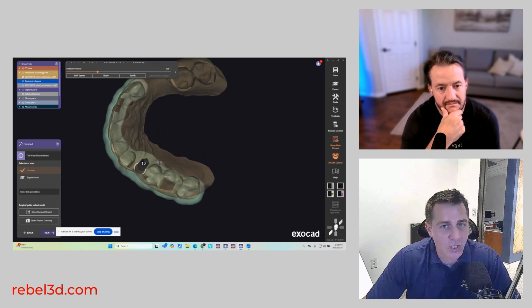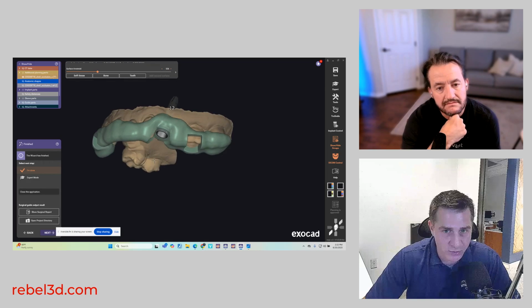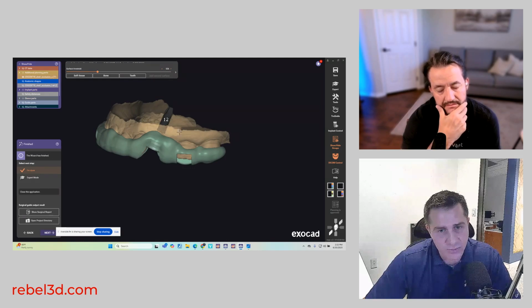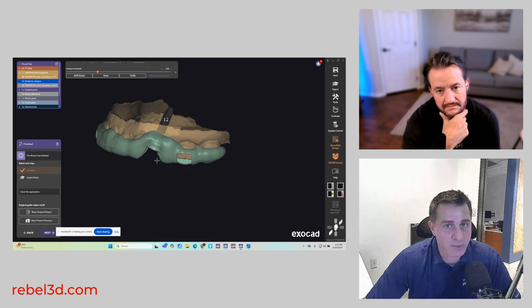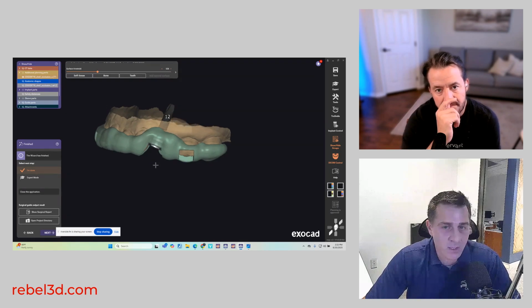But you also have to know how to deal with complications. Let's say the bone is not quite as hard as you anticipated, or the implant's a spinner, so you need to know how to maybe step up a size or something like that. And then, of course, with all this planning, okay, I do have a good bit of volume of bone. Maybe you underplan it. You plan something a little bit smaller, but if the bone's soft, you plan on placing something a little bit larger.